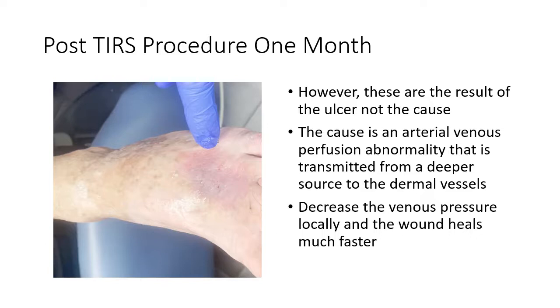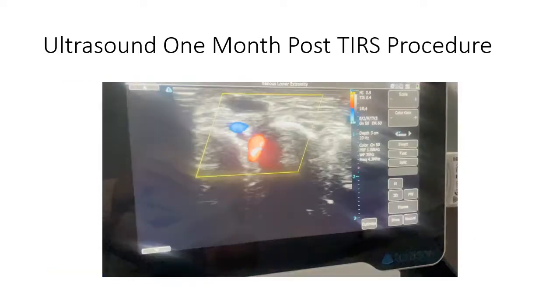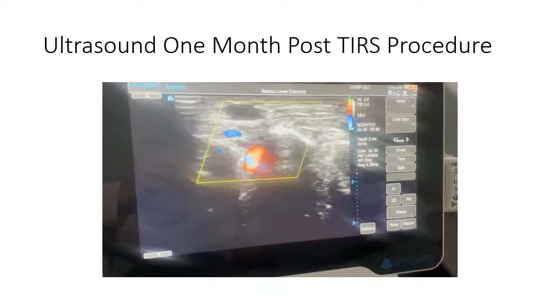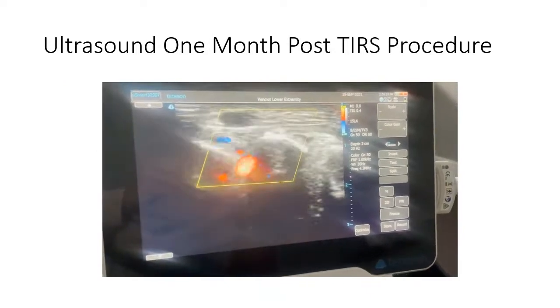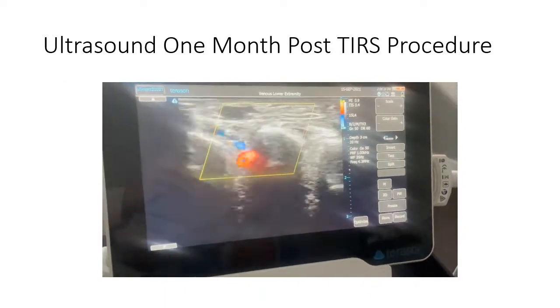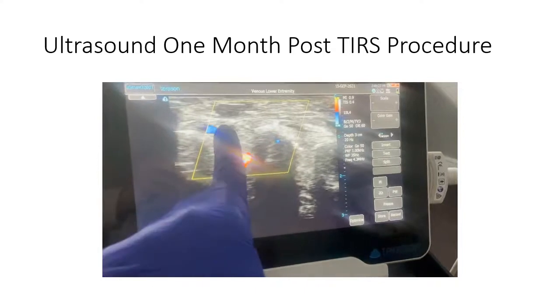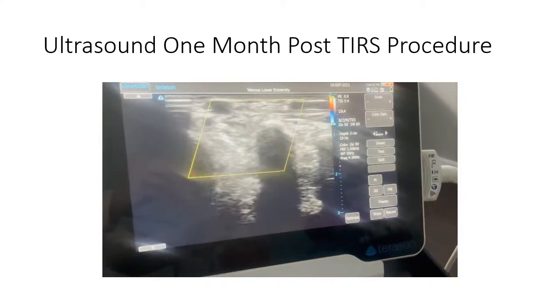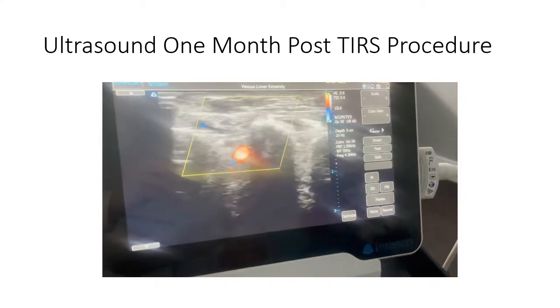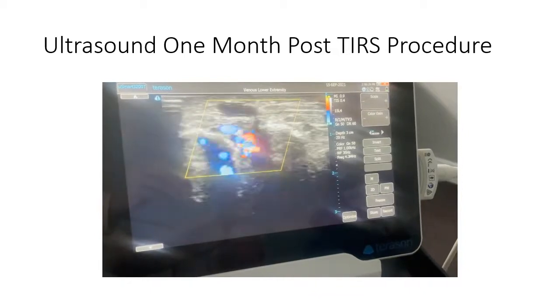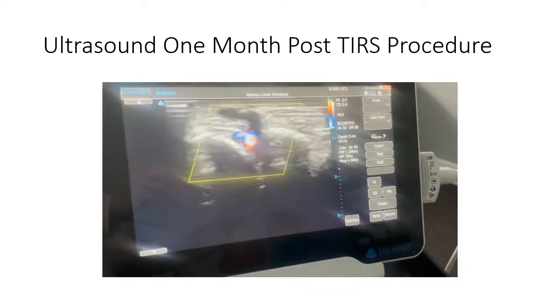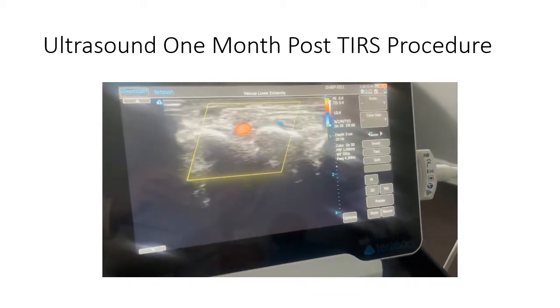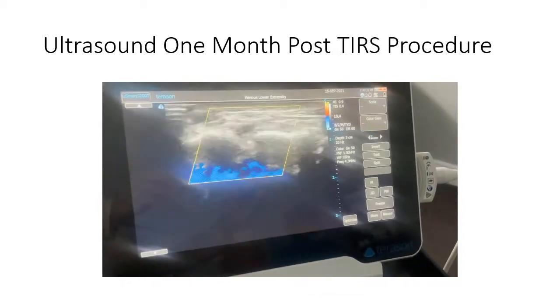If you can decrease the venous pressure locally, the wound will heal much faster. This is the ultrasound of the perforator. You can see distally right here, going down towards the ulcer bed — this is still clotted off. The ulcer is healed. There's a perforator there with a lot less flow in it than there was before.